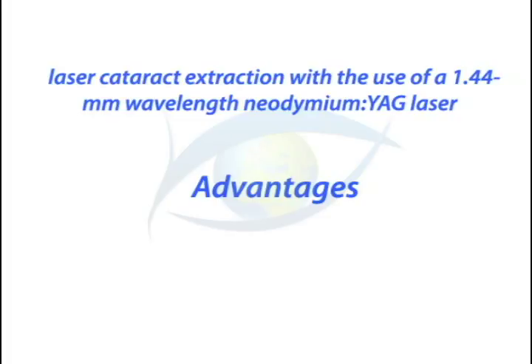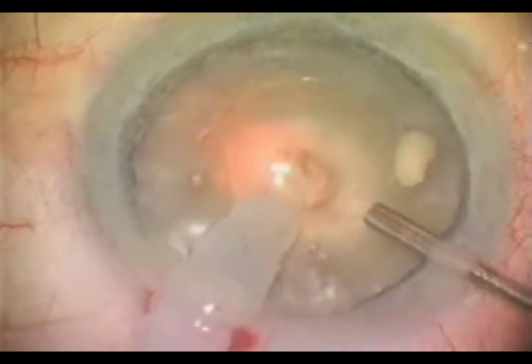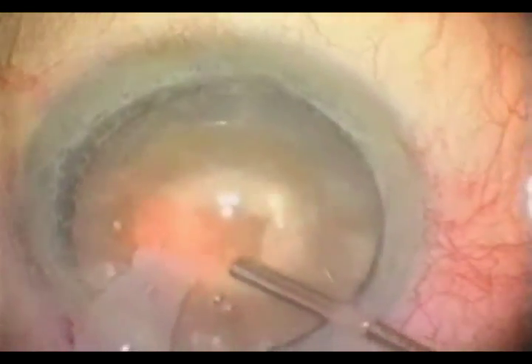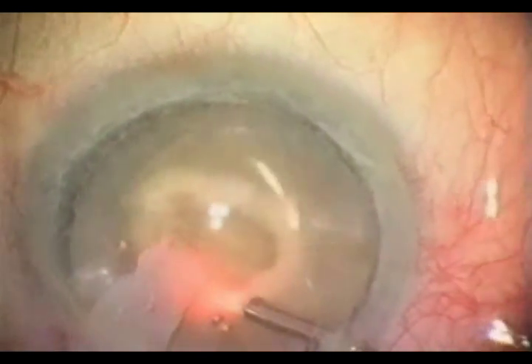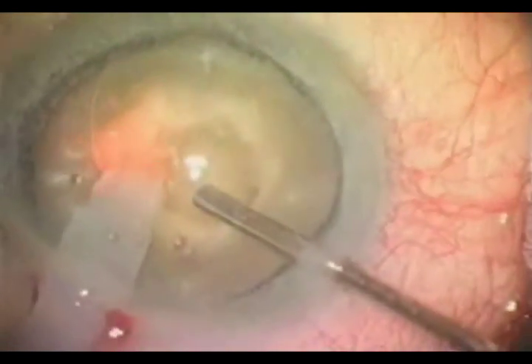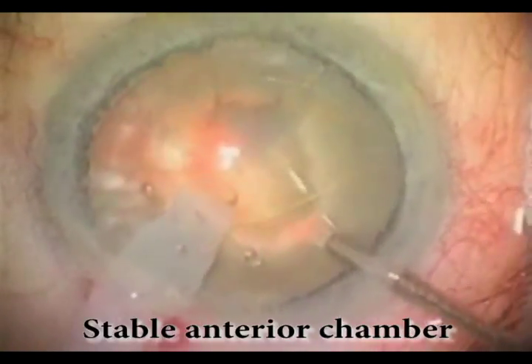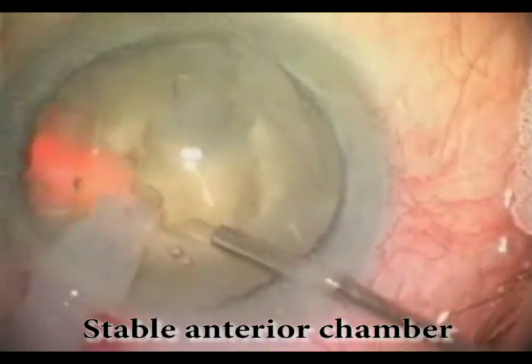Finally, we can summarize the advantages of this technology as follows. This elaborated surgical technology of laser destruction and cataract removal is fulfilled by a slight touch of the laser tip to the lens surface, without mechanical fragmentation of the nucleus or pressure on the lens, with special protection of the posterior lens capsule by the silicone shield on the working piece of the irrigating aspirating tip. It allows destruction of cataract of any density. Absence of hitting of the laser tip and surrounding tissues in the working zone allows sealing the anterior eye chamber with working tips, stabilizing intraocular pressure during the surgery and excluding any traction of zonular fibers caused by turbulence of the anterior chamber.